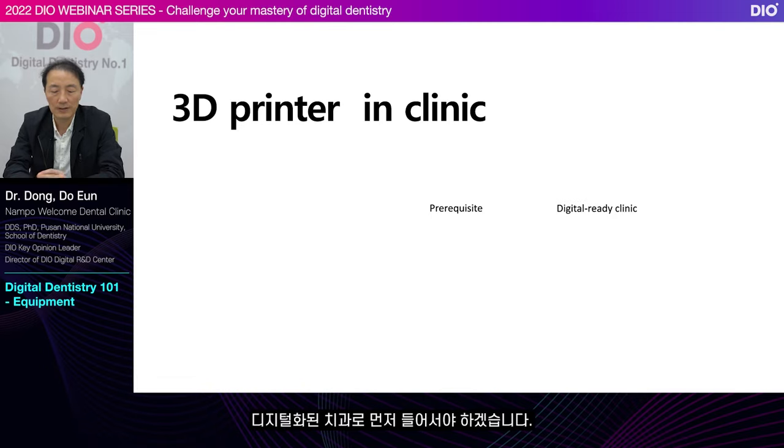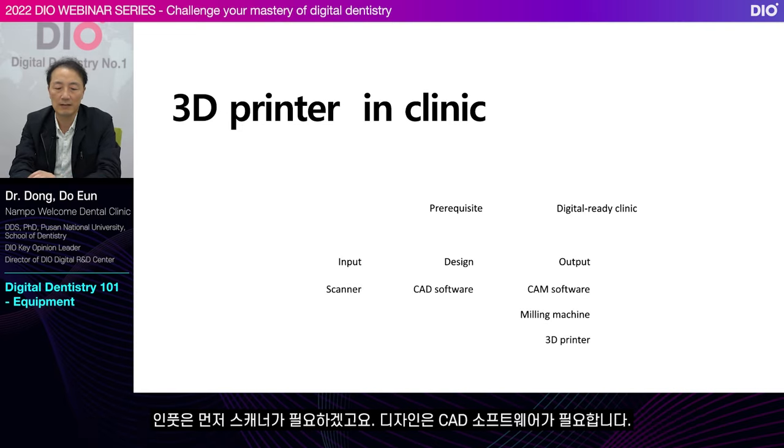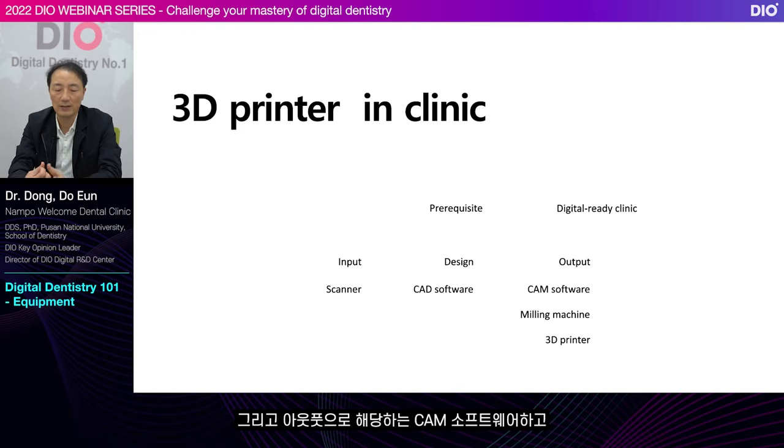You would need to turn your clinic into a digital-ready clinic first. A digital-ready dental clinic refers to a clinic where the input and design output are all done in a digitalized process. For the input, you first need an oral scanner. For the design, you need a CAD software. For output, you need the corresponding CAM software, milling equipment, or a 3D printer.